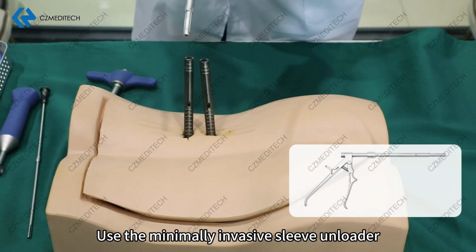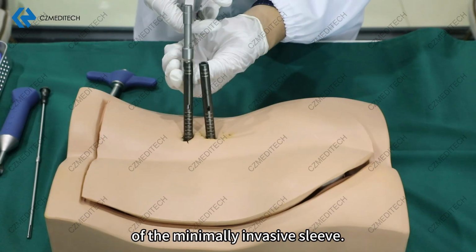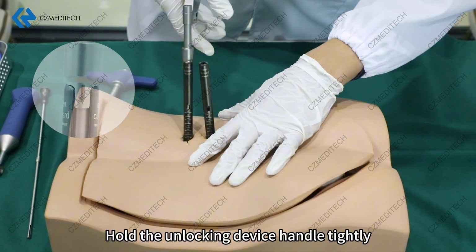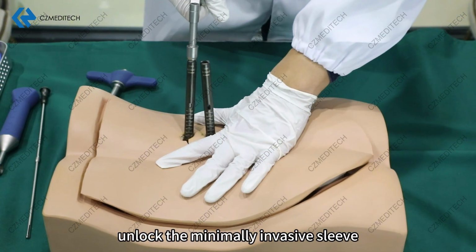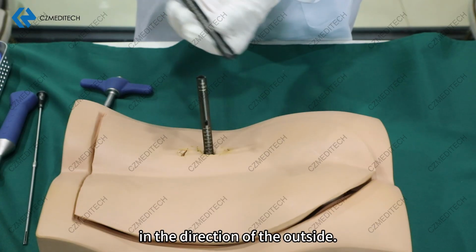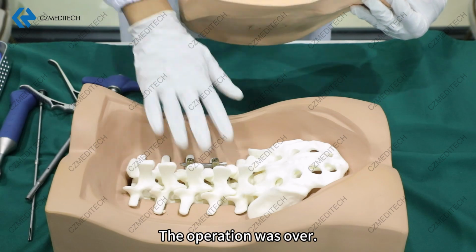Use the minimally invasive sleeve unloader to insert into the minimally invasive sleeve to the bottom. Hold the unlocking device handle tightly. Unlock the minimally invasive sleeve and pull out the minimally invasive sleeve in the direction of the outside. The incision on the skin surface was sutured. The operation was over.